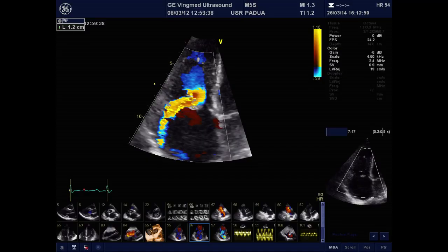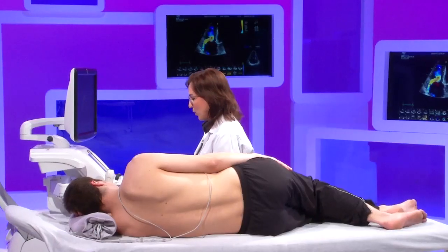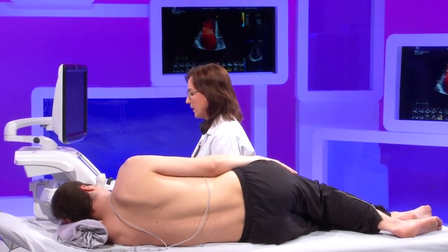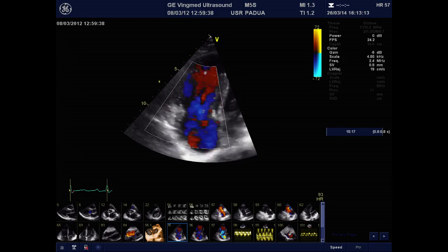and then you measure the radius of the first convergence area, which in this case is 12. The cutoff for severity is 9, so this is suggestive of severe tricuspid regurgitation. Again, this is for demonstration purposes. The flail by itself is a very important criterion of severity. Then another important semi-quantitative parameter that we can obtain is the vena contracta.